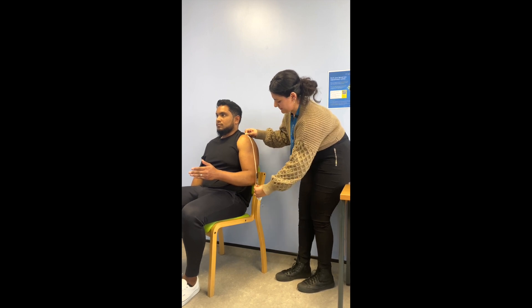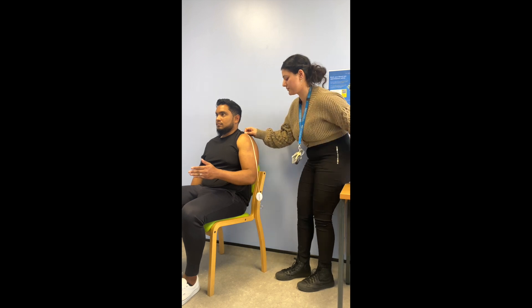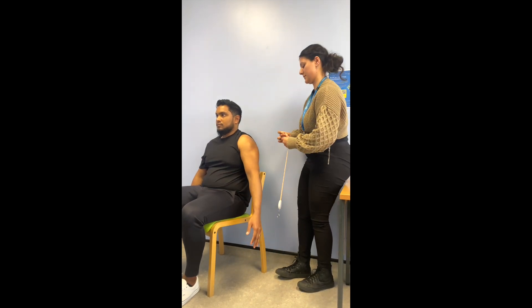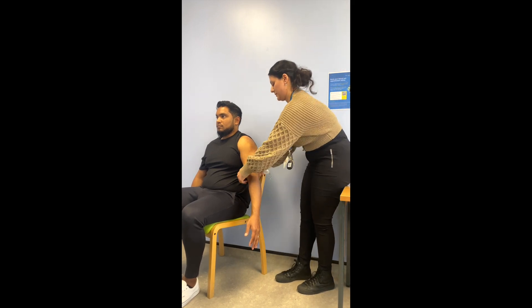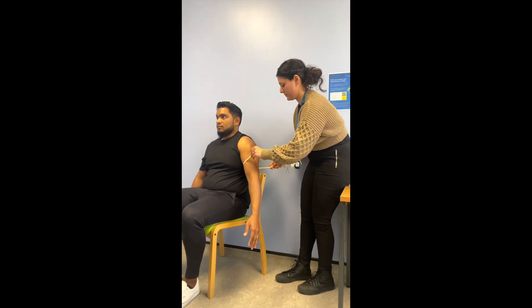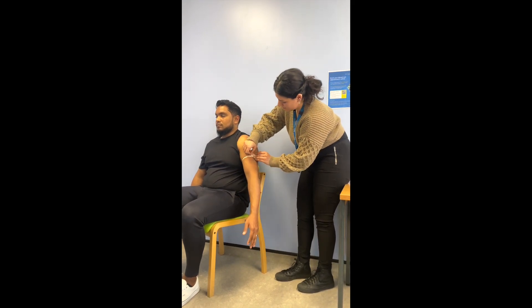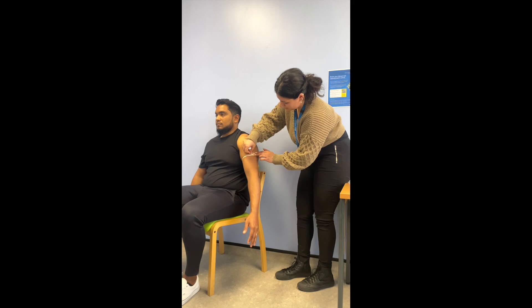For example, if you measure 20 centimetres, the midpoint would be at 10 centimetres. Next, allow the resident to relax the same arm on the side of their body and take the tape measure around the arm at the midpoint you have identified. The circumference at this midpoint is the resident's MUAC.